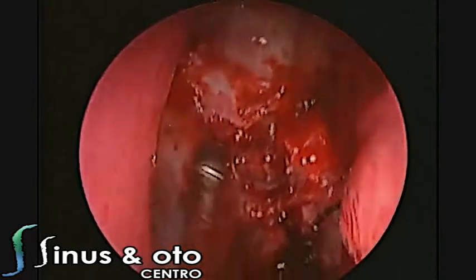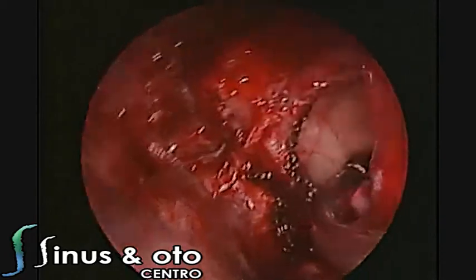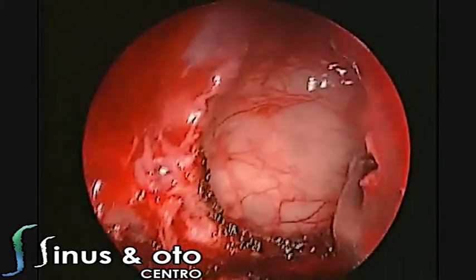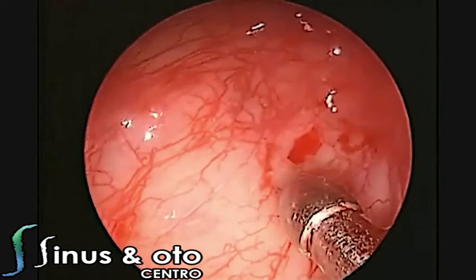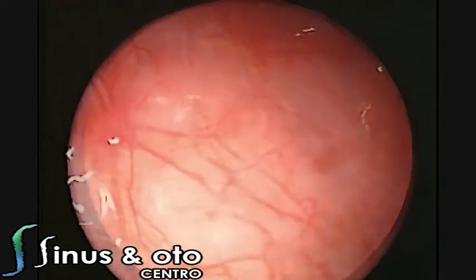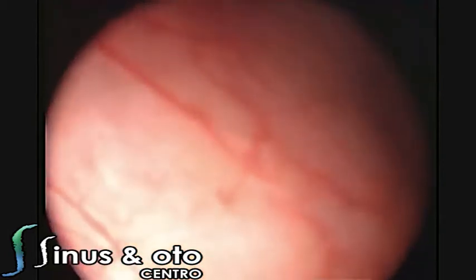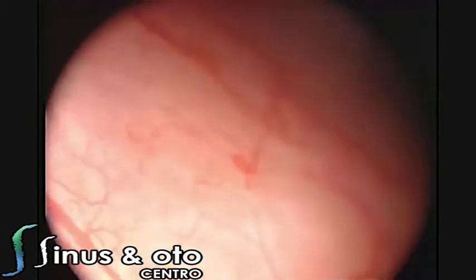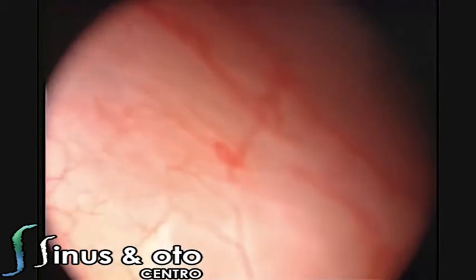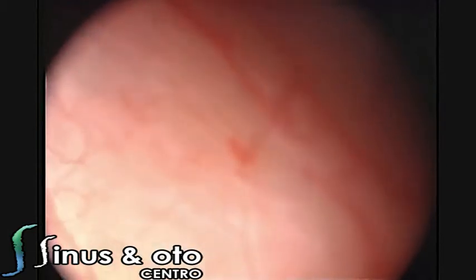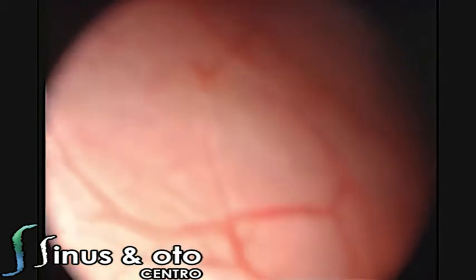You can see the mucocele content on the skull base. This is the left side maxillary sinus which was opened — there was no disease inside. This is the power of the endoscopes: you can have a very close-up view of very small, tiny little vessels.